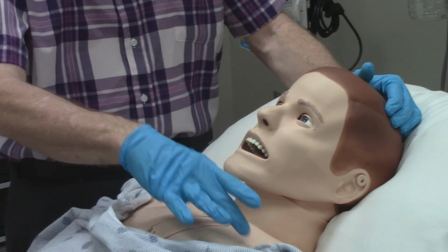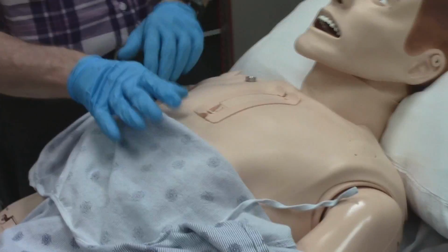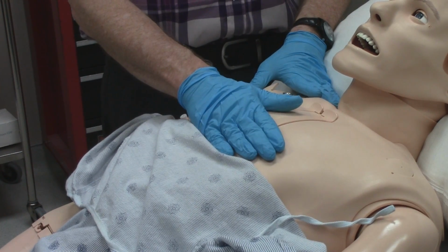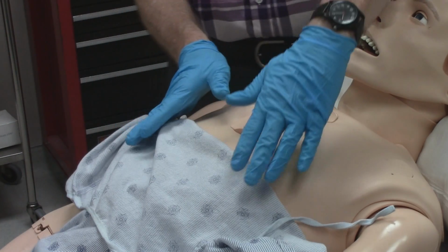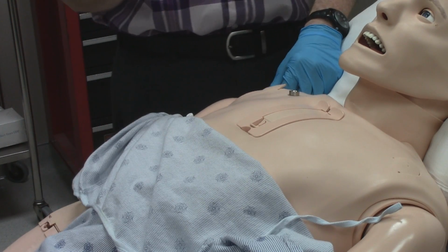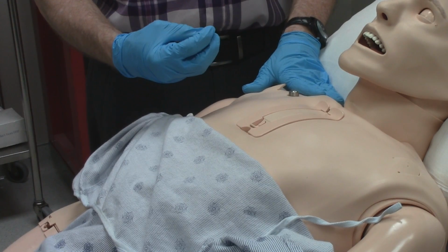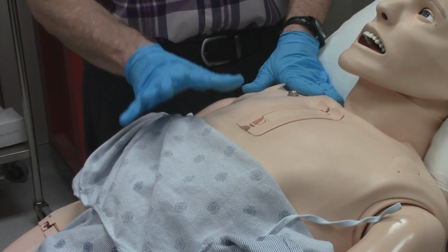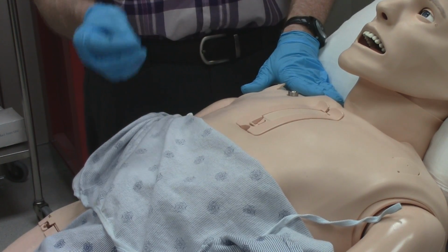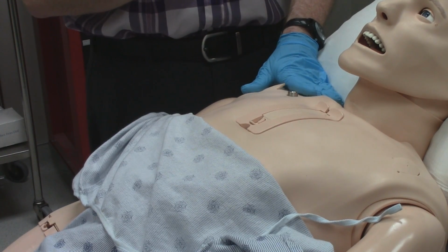These mannequins also can simulate a pneumothorax. We can simulate collapse of the lung on either side of the chest. When the pneumothorax feature is activated and the patient is breathing spontaneously, you will see an asymmetrical chest rise, so the side that's affected by the pneumothorax will not move. If you ventilate the patient with a bag valve mask when a pneumothorax is present, the side that the pneumothorax is on will not move. Also, when you have a pneumothorax, you will lose the breath sounds on the affected side of the patient's chest.